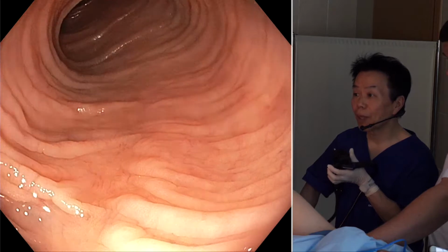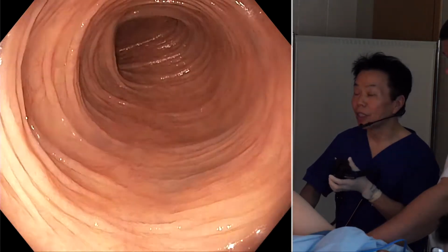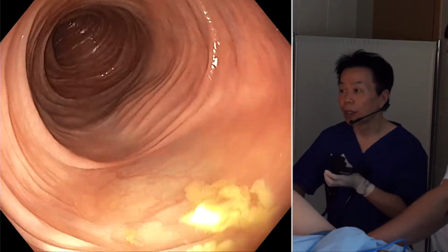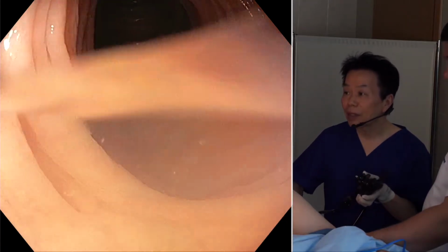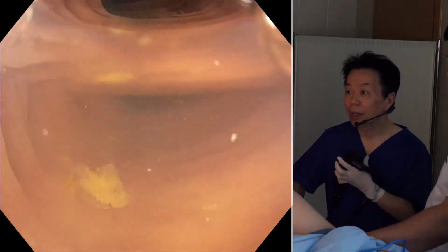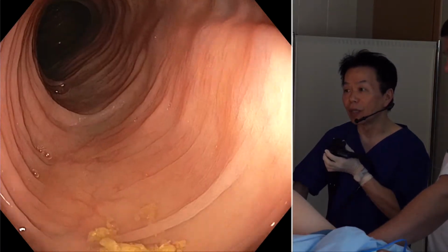And some people prefer to use a cap during the intubation and observation too, but I don't use them routinely. But I put a short tapered cap every time for colorectal ESD. Tapered cap, but I don't routinely use any cap for the observation.